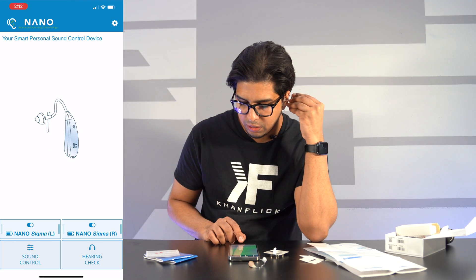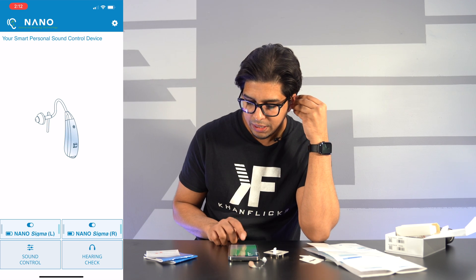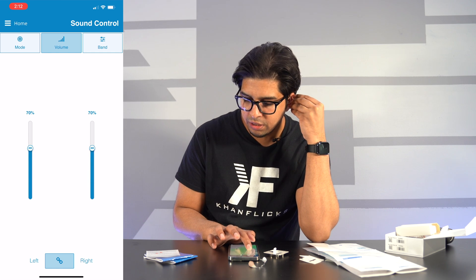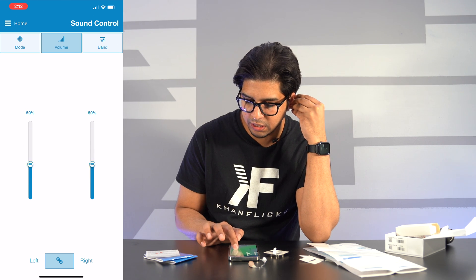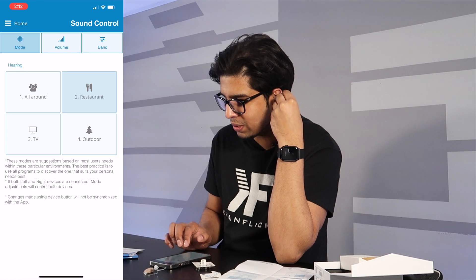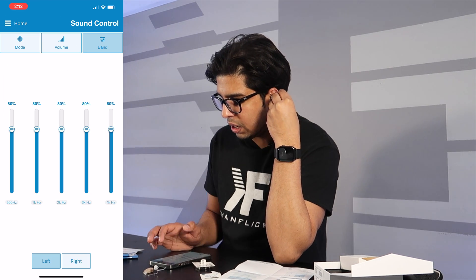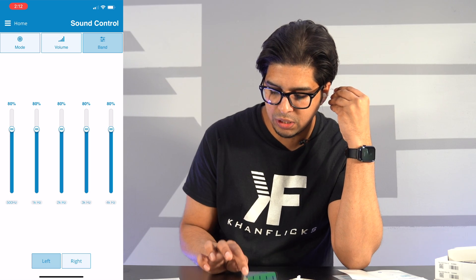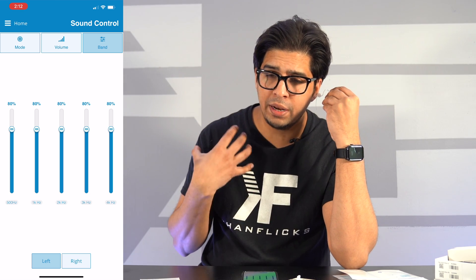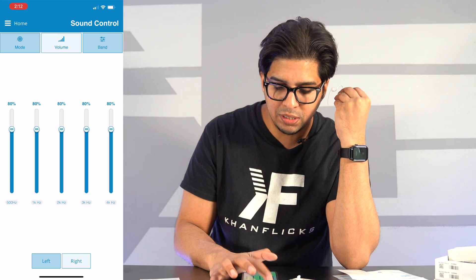Now that we have it ready to go, I can actually hear myself — it's interesting. I can click on 'Sound Control' and adjust the volume based on my personal preference, either left or right. Based on where you are, you can control it — if you're in a restaurant, watching TV, or outdoors — and then you have your exact frequency settings so you can fine-tune it. If you want to amplify a certain frequency range, it's up to you.